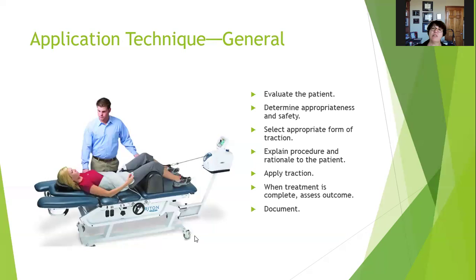So in general, obviously evaluate the patient and determine the appropriateness and safety. Select the appropriate form of traction. Are you going to do static or intermittent? Are you going to do manual or mechanical? You're going to explain the procedure to the patient. You're going to apply the traction. When the treatment is complete, you assess the outcome and you document.